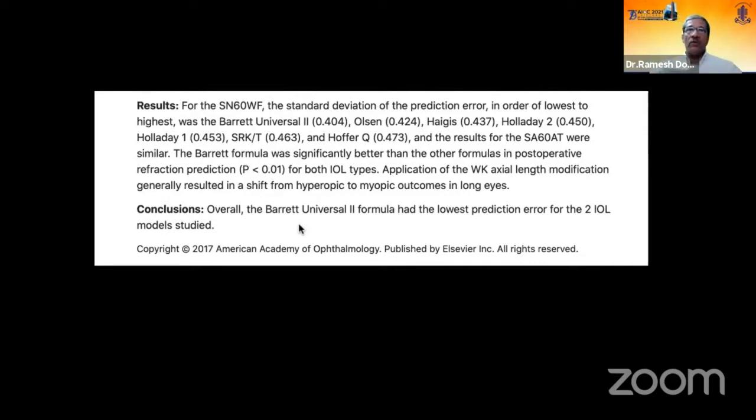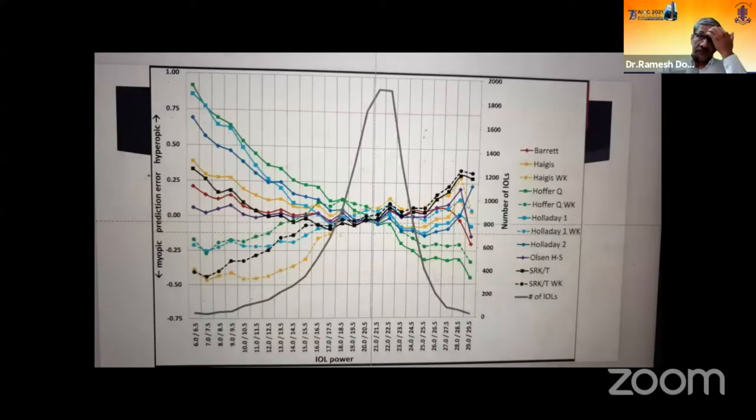So it's important to use a good quality lens, and one of the most repeatable instruments is the LENSTAR. If you look at the current generation of formulae, both Hill RBF and the Barretts are based on LENSTAR measurements and the Alcon single piece platform. We really don't have formulas which have been derived from the other instruments.